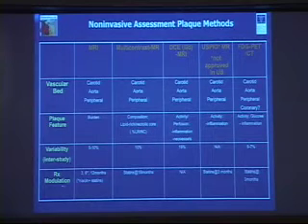Putting it outside in the field, there have also been small studies showing that if you do some kind of intervention, and this would be more pharmacological, such as the use of lipid-lowering drugs or lipid-lowering at different intensity, and Jonathan will talk about a nice study he has, but also, let's say, an LDL-reducing drug and an HDL-increasing drug, you should be able to see the difference. We lack a little bit more of the large studies. I'll talk to you about a study that's ongoing, to give you an example. So now, different flavors of MRI, and the difficulty increases as I move forward.